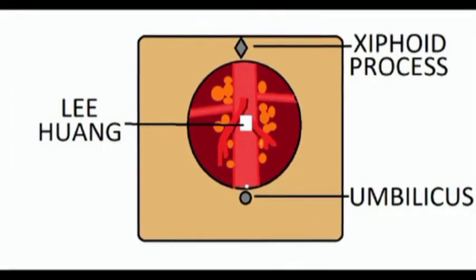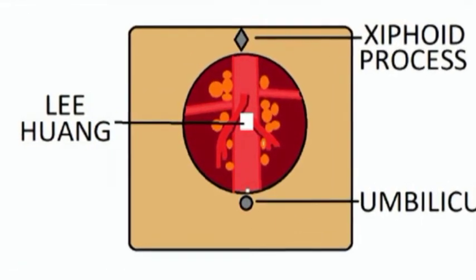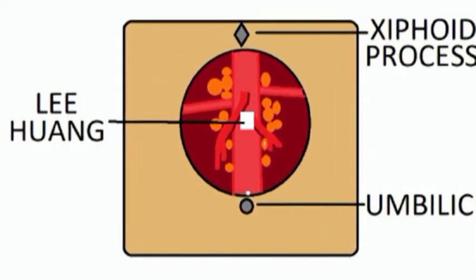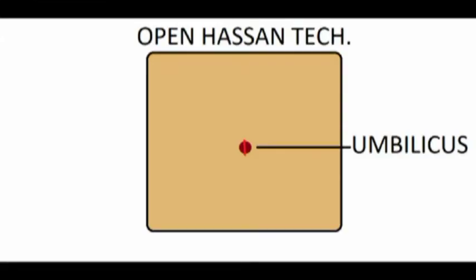It is in the midway between xiphoid process and umbilicus. Though it gave some help due to its higher location and central vision, this point is not very safe. In one study of 188 cases, 2 omental and 1 colon injury were reported. There is one other approach called open-Hasson technique. It is to remove adhesion.